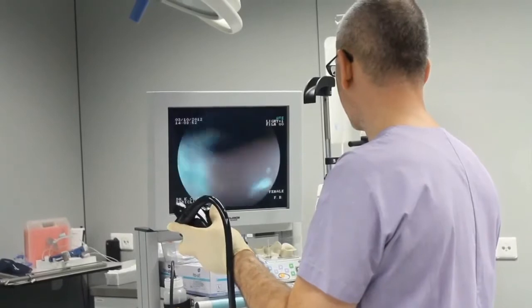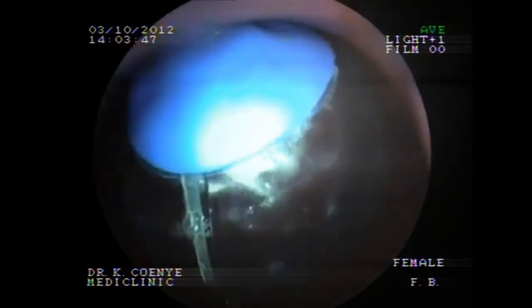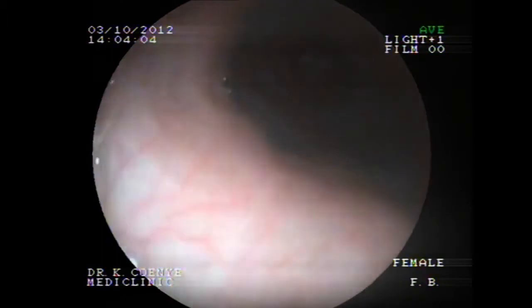Using the endoscope, check both the integrity of the balloon as well as its good positioning under the cardia level. Do not try to place the endoscope behind the balloon. Finally, withdraw the endoscope after this final check.